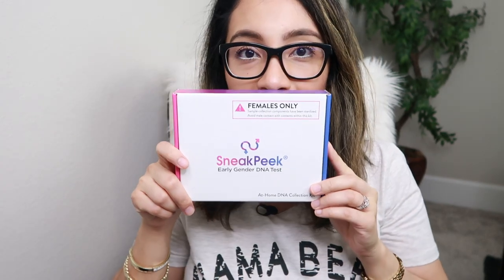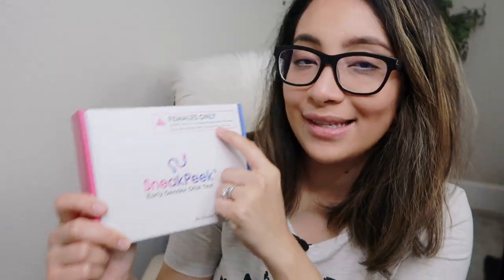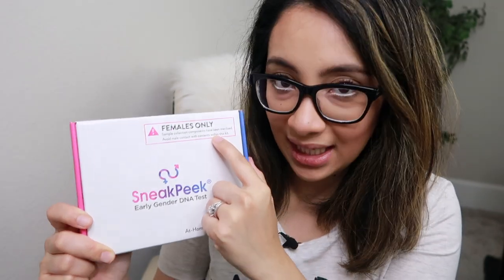So this is what the box looks like. It says here: females only. Sample collection components have been sterilized. Avoid male contact with contents within this kit.